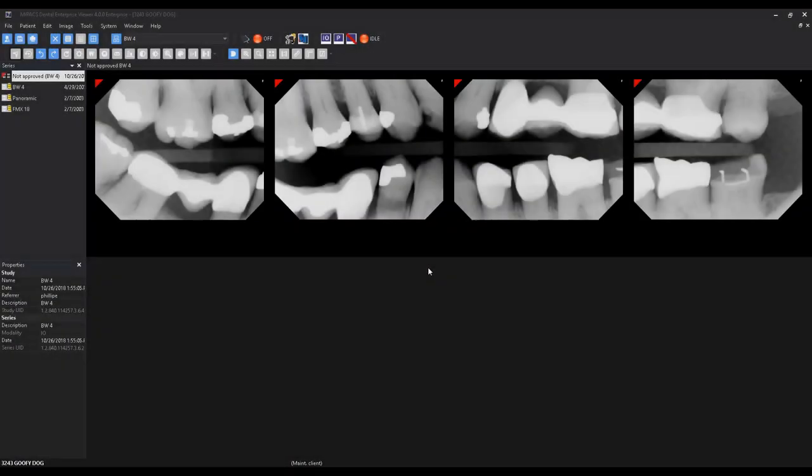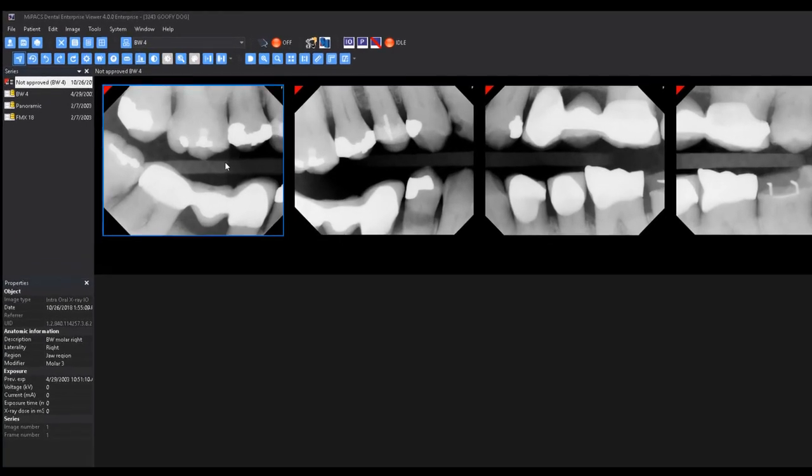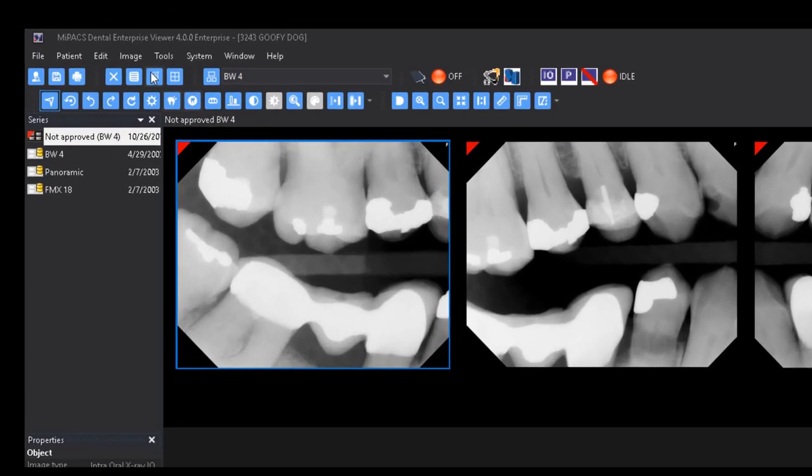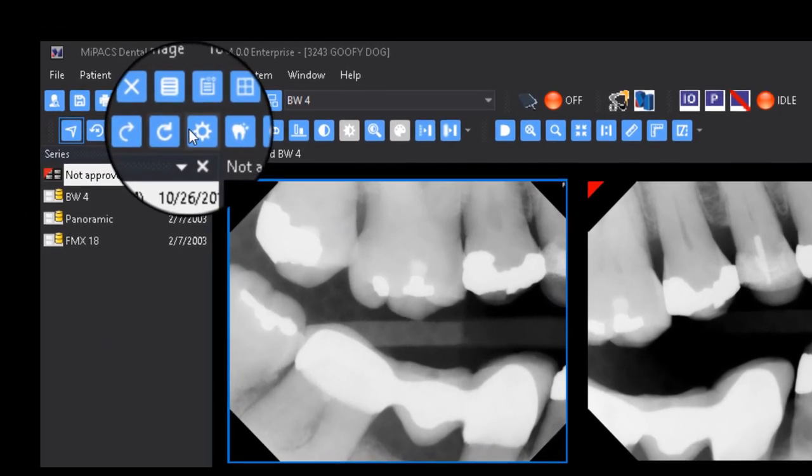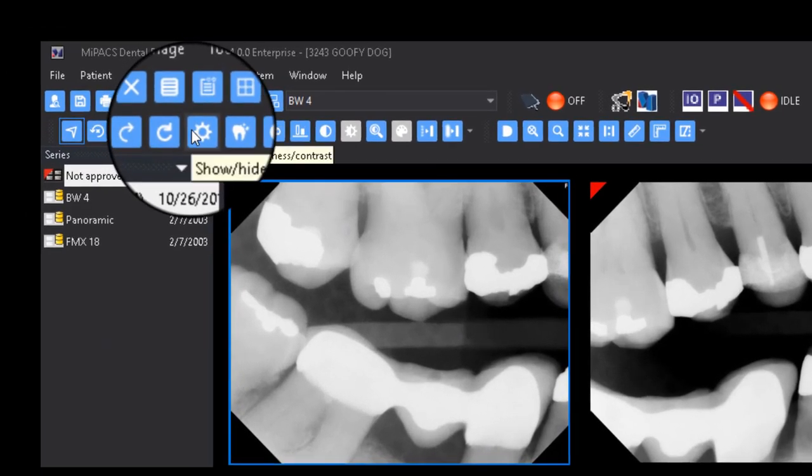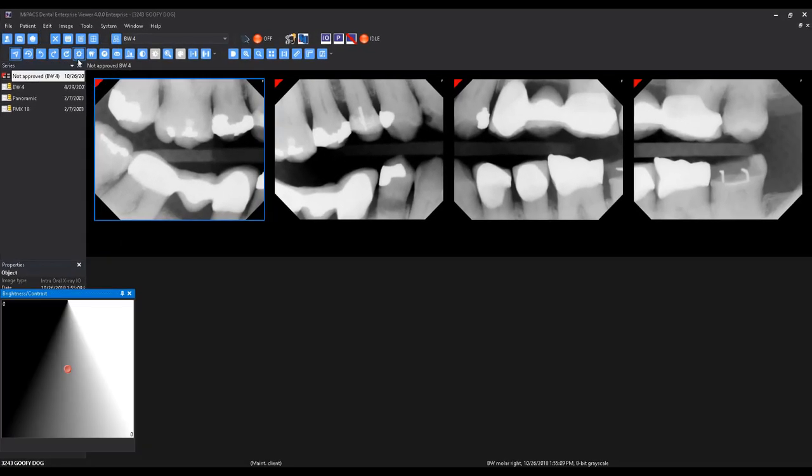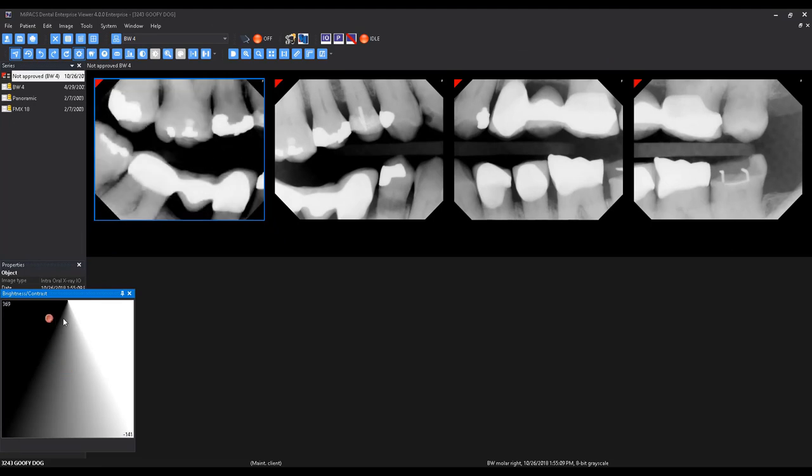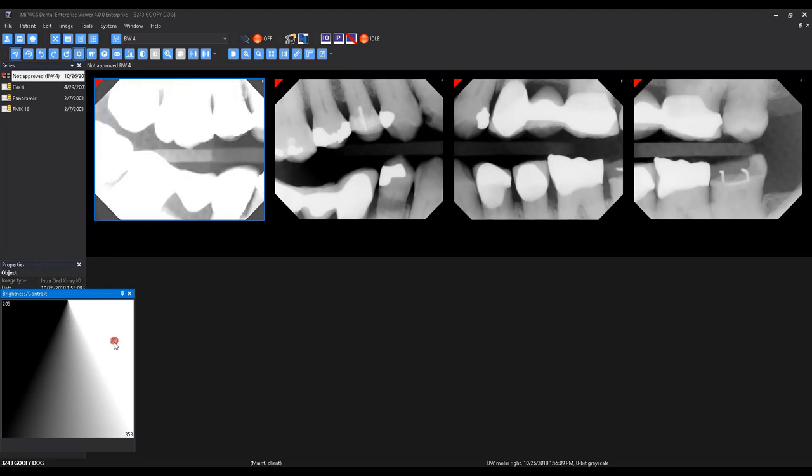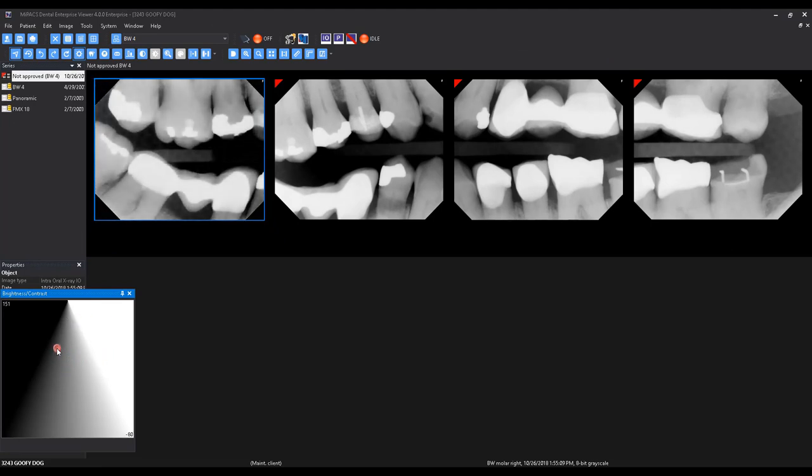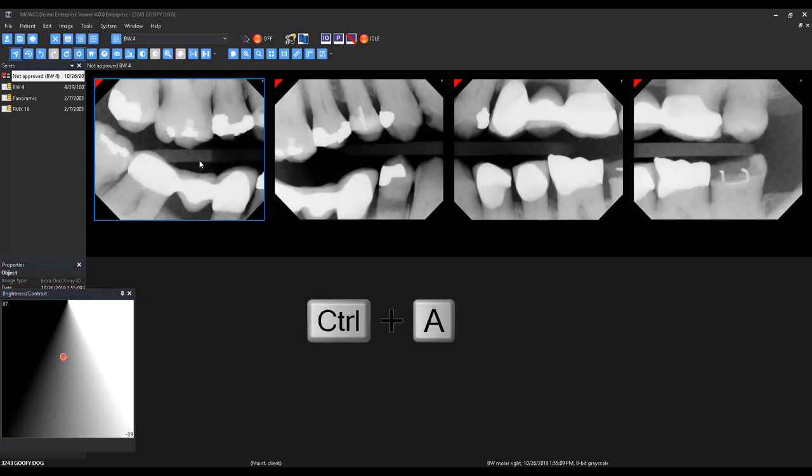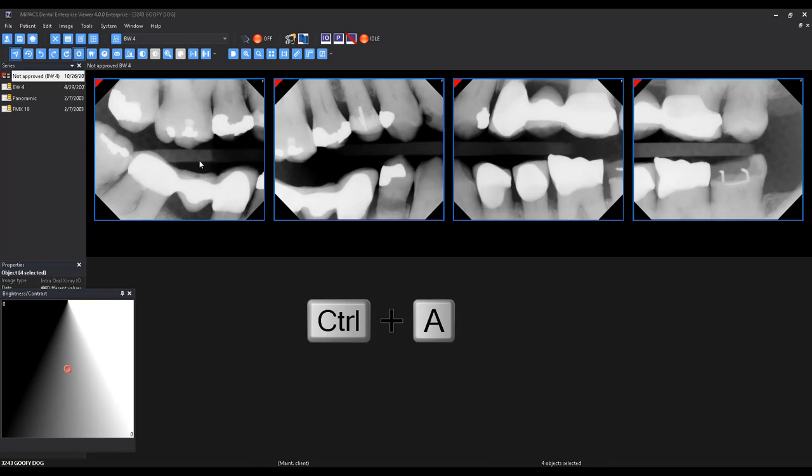To adjust the brightness and contrast of an image, select the toolbar icon that looks like a sun. This will display the brightness and contrast dialog. You can use this dialog to adjust the brightness and contrast by dragging around the red dot inside of the dialog. You can also highlight multiple images by holding down Control-A, which will allow you to adjust the brightness and contrast of all images currently selected.